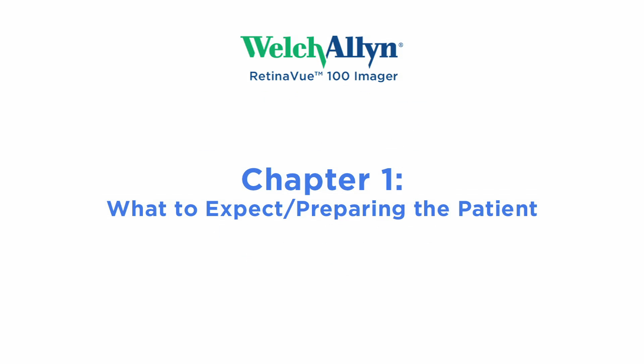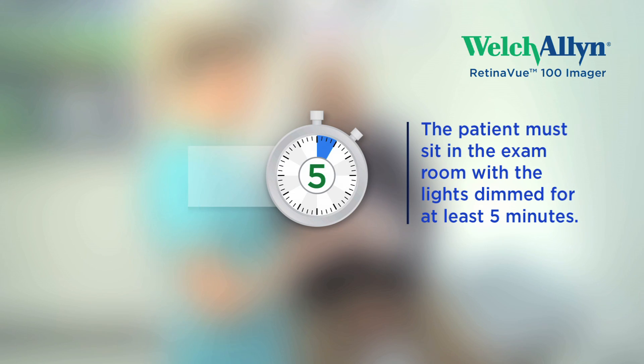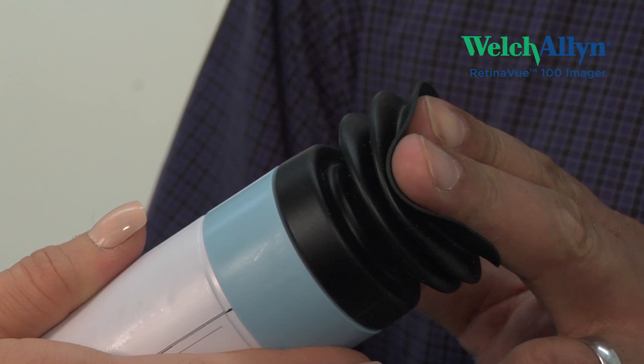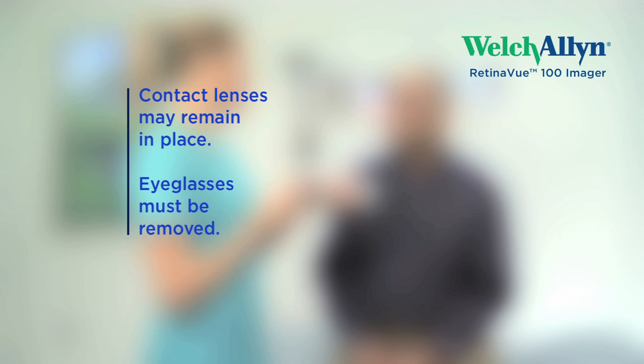Chapter 1: What to Expect — Preparing the Patient. Ask your patient to sit in the exam room with the lights dimmed for 5 minutes. This will allow their pupils to fully dilate. Let them feel the collapsible eye cup. Contact lenses may remain in place. Eyeglasses must be removed.